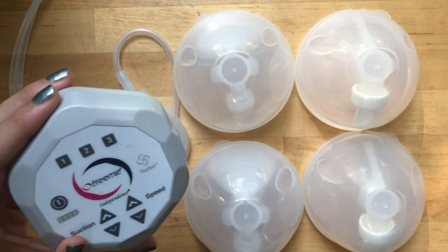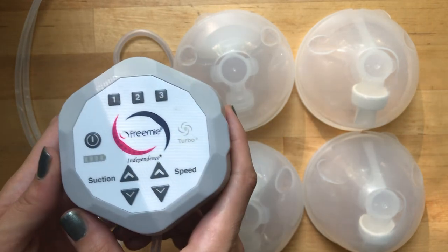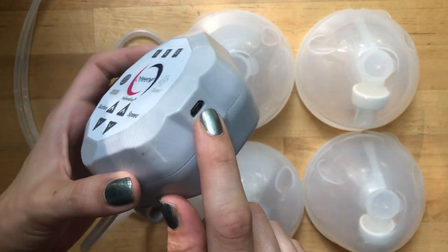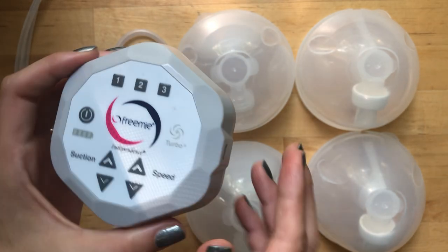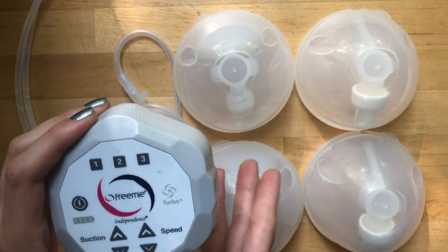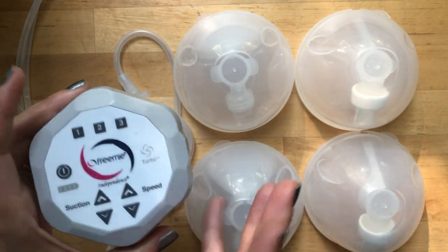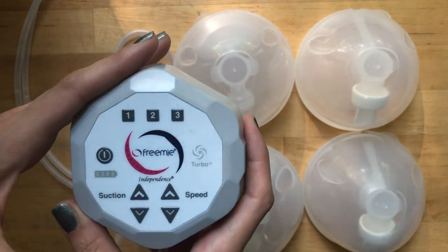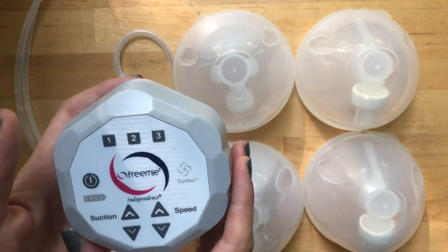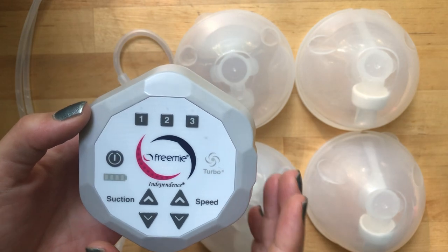I actually really like this pump. The main reason is it allows me to be pretty mobile and to recharge it, so I don't have to worry about batteries. I have a battery adapter for my Medela and I was using that, but it's very clunky to carry around - even with the battery pack you still had to carry the pump in a bag plus the battery pack, so it wasn't the most convenient way to be mobile while pumping. This one has done the trick.